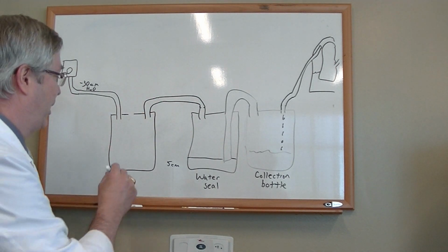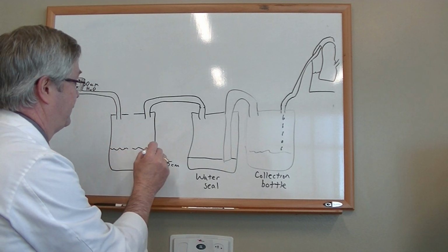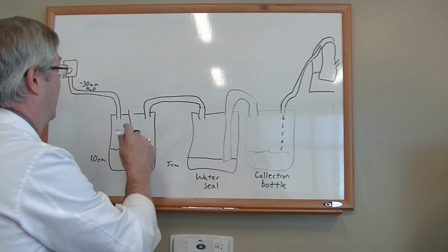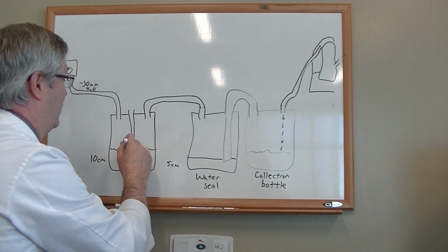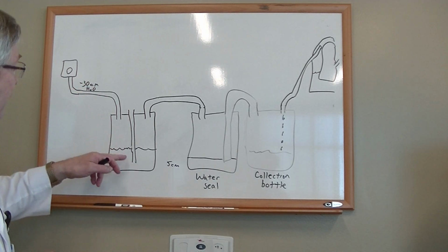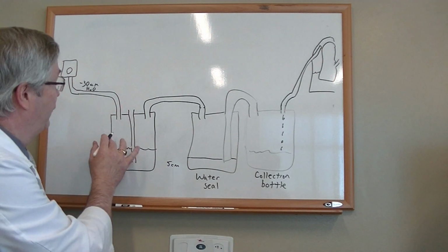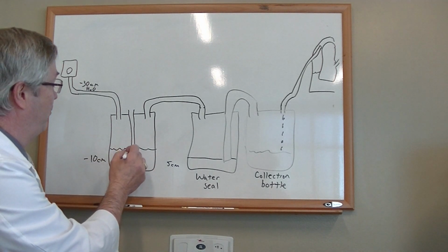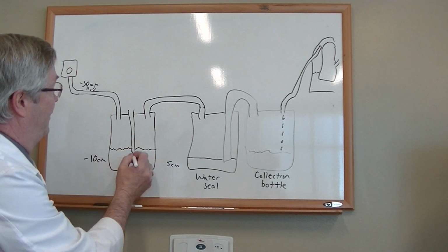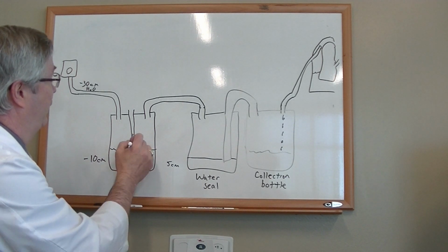So we're going to regulate it by putting a column of water of 10 centimeters of water, let's say. And then we'll put a tube down into that. Now, if we have minus 30 centimeters of water and it comes into this space, this will be able to accommodate that minus 30 and turn it into minus 10 by bubbling coming up this way. So this water will be drawn up into this space until it gets up to minus 10, and then bubbles will come out of here. Okay, so we'll see it bubbling constantly.